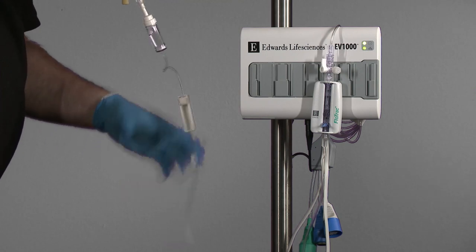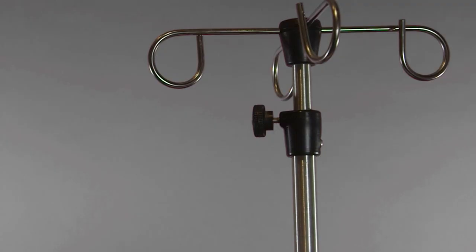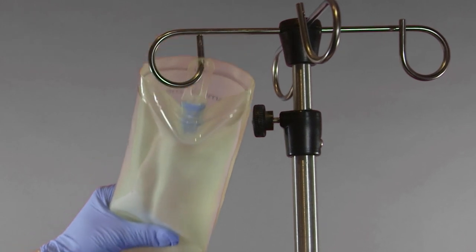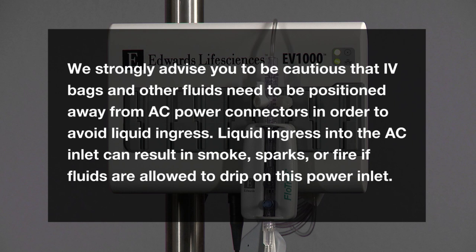Insert the flush bag into the pressure infuser bag and hang on the IV pole, but do not inflate the infuser bag. We strongly advise you to be cautious that IV bags and other fluids need to be positioned away from AC power connectors in order to avoid liquid ingress. Liquid ingress into the AC inlet can result in smoke, sparks, or fire if fluids are allowed to drip on this power inlet.